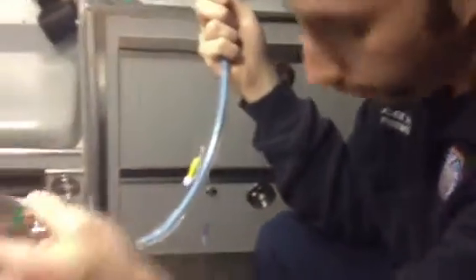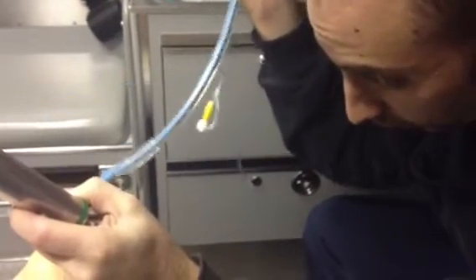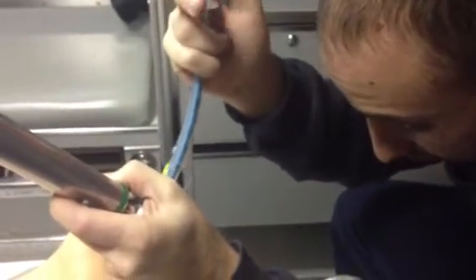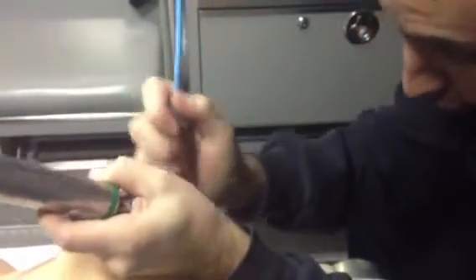So we're going to go ahead and intubate. We only see the bottom of the airway, so we're going to quickly advance our bougie and go ahead and place it in. We advance it feeling the tracheal rings, and then we just advance it a little further with the tube.